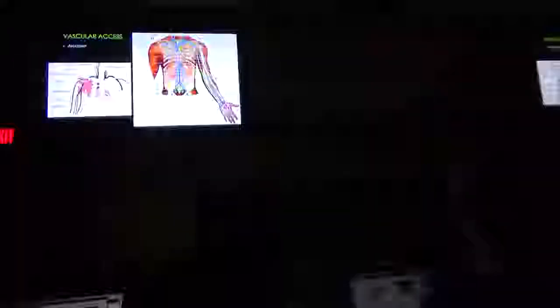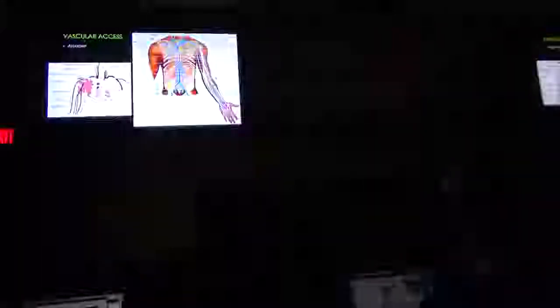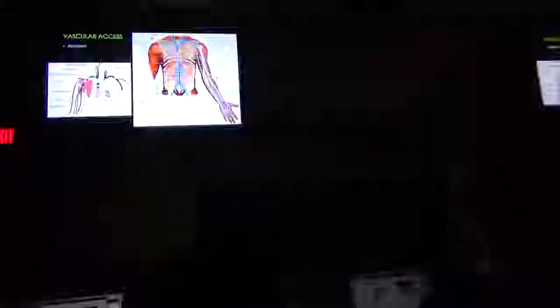Risks and benefits of peripheral lines. Just like anything else, I always, with doing any type of procedure, would explain to my patients there's always going to be, anytime I cut the skin, a risk of infection, complications of blood clots developing, complications of bleeding. Okay. We try to protect that as much as possible, obviously by doing sterile technique, and you'll explain that to the patient.